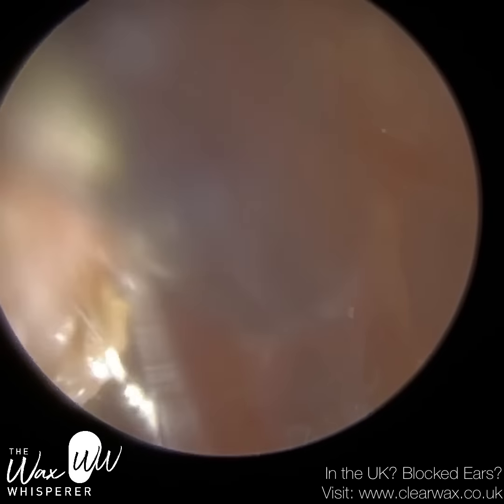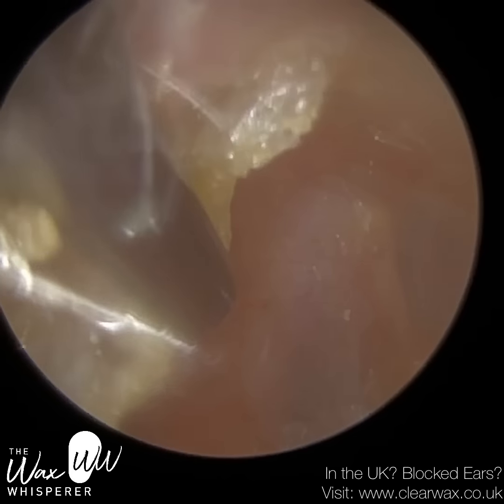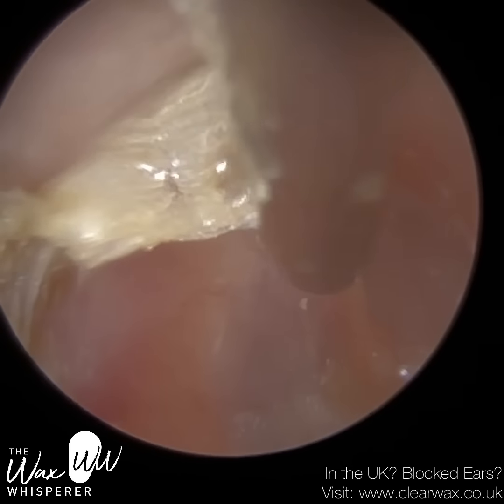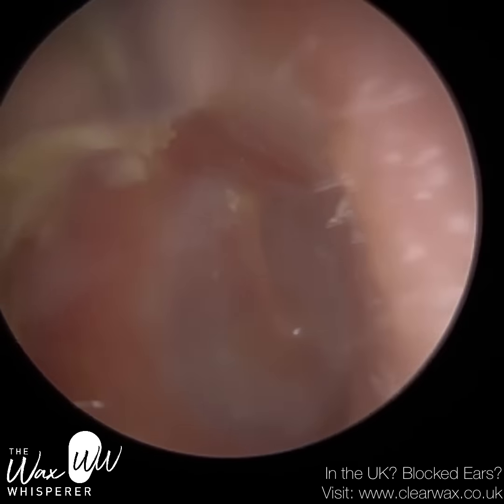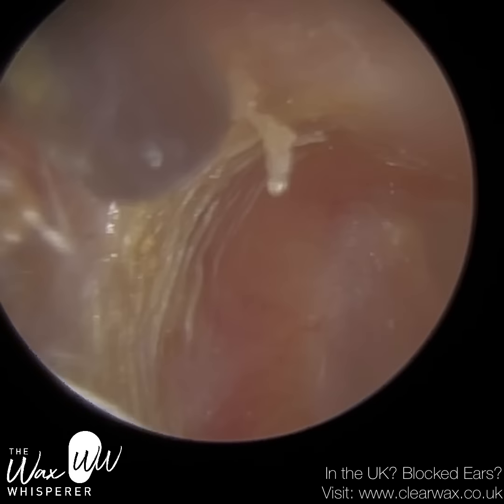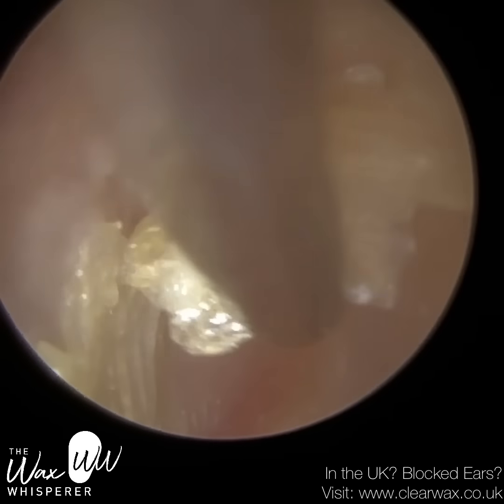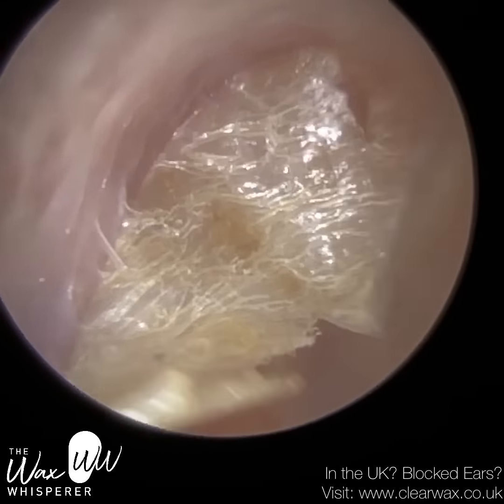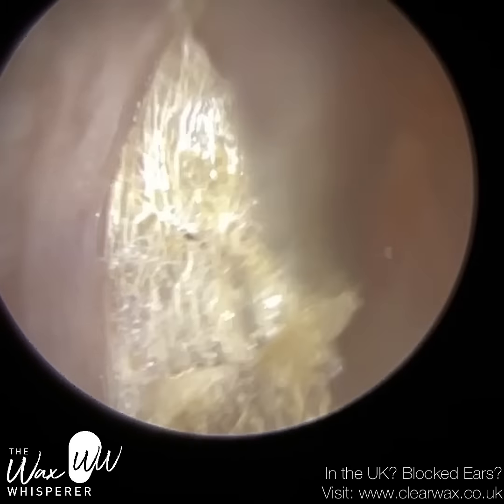So just got a bit of skin left. I'm working from the back first, peeling it down and away. I always like going towards the centre with the suction probe. And you've got to be careful not to over-peel, because what can then happen is you lose control of the tip of the sucker, and that sucker can, in an attempt to peel this away, swing across to the other side of the ear canal and make contact, and that would be really uncomfortable. So you can see it's a lot of skin here. I would say it's a complete total skin peel of the whole ear canal.